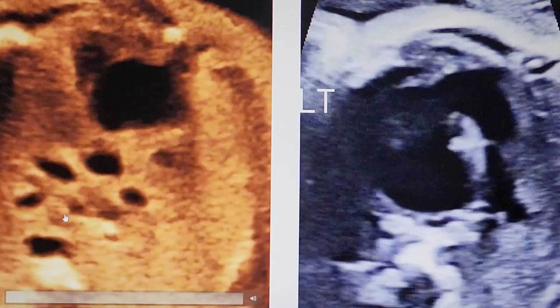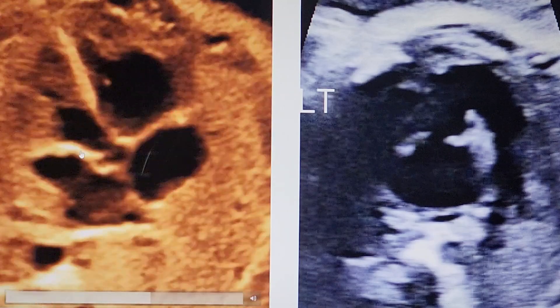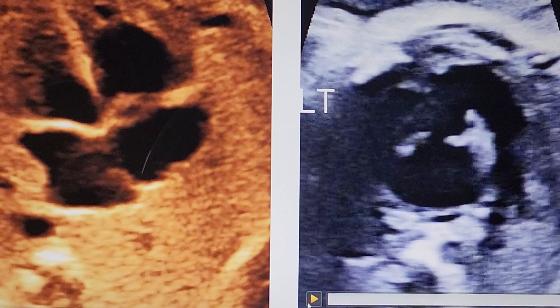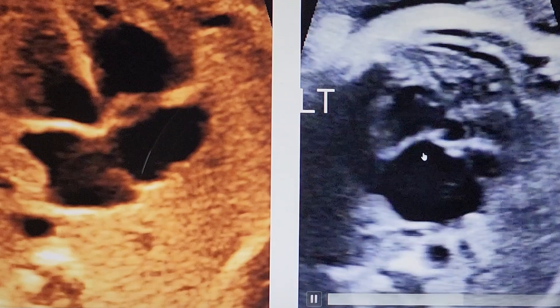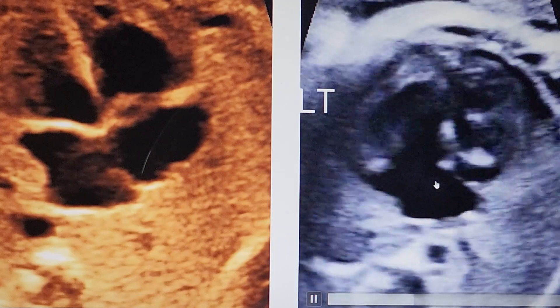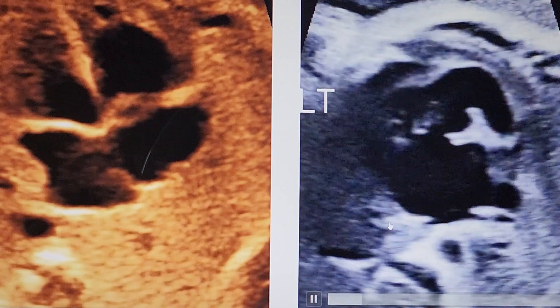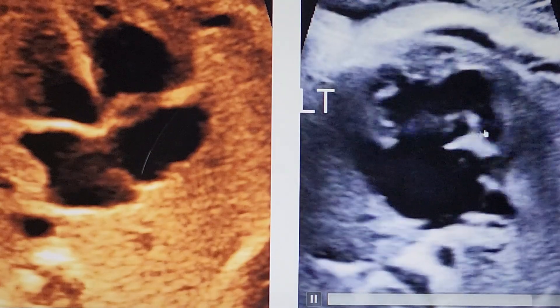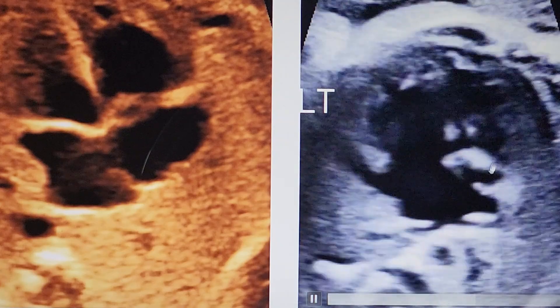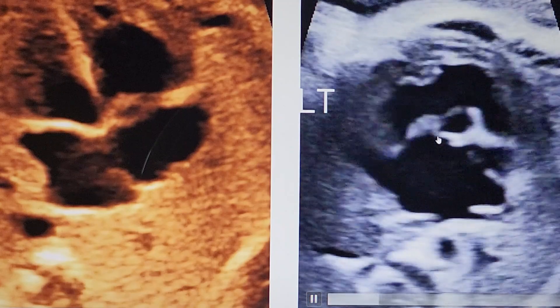Now look at the valves. In the normal case we have a crux, an apical insertion of the tricuspid valve, a basal insertion of the mitral valve, and two normally opening and closing atrioventricular valves. In this abnormal case, we find only one opening and closing atrioventricular valve on the left side — this is possibly a normal left atrioventricular valve. The right-sided atrioventricular valve is significantly thickened, echogenic, and not opening at all, indicating atresia of the right atrioventricular valve.